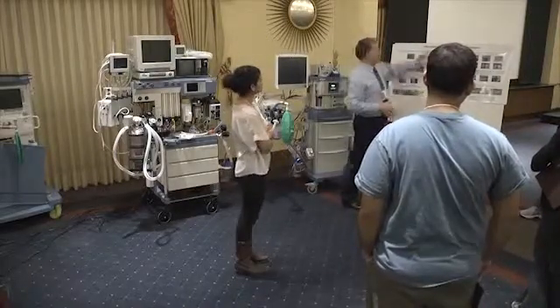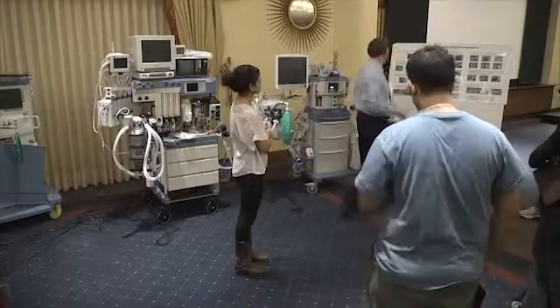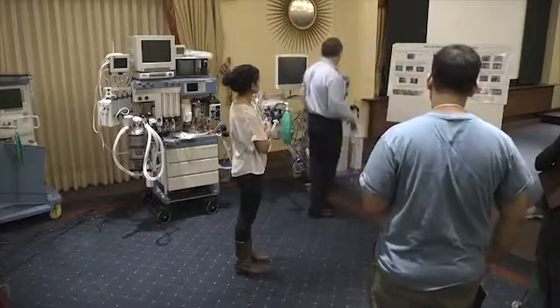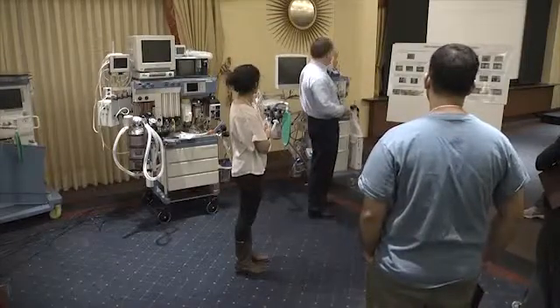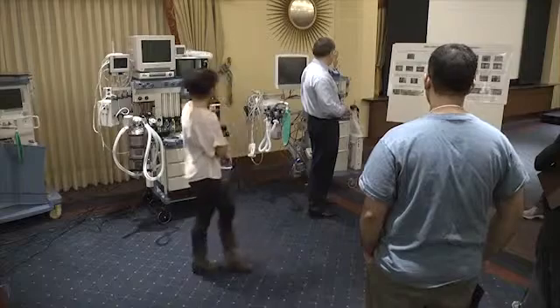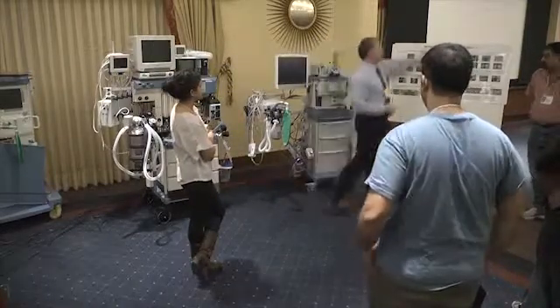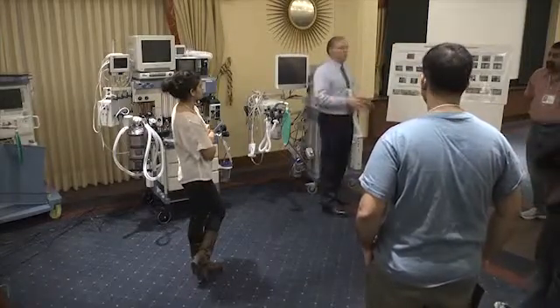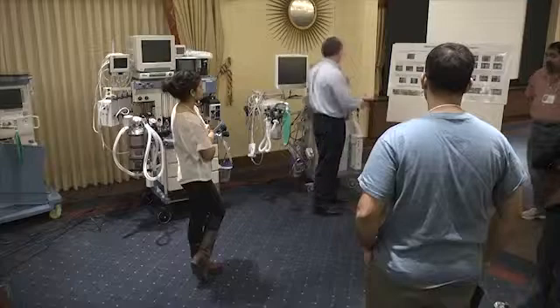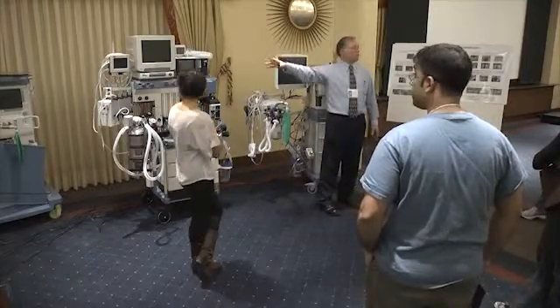The next step is a machine-specific test. In other words, it works specifically on the Fabius. And as you look on this machine, there's a run system test, there's a calibrate flow sensor test, calibrate the O2 sensor, and then your leak and compliance test. You step through these steps, and that's what these steps kind of illustrate, things that you have to set up with the machine to do these tests. And that's machine specific. So in this particular area, we would do something with the other machine.